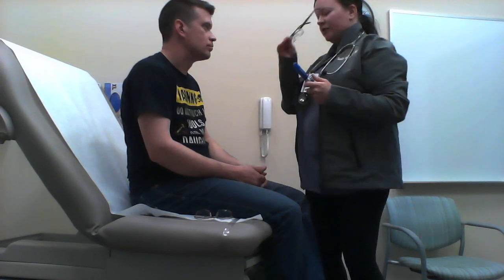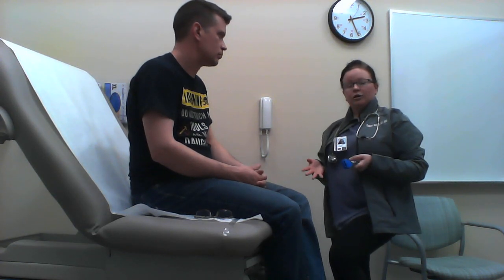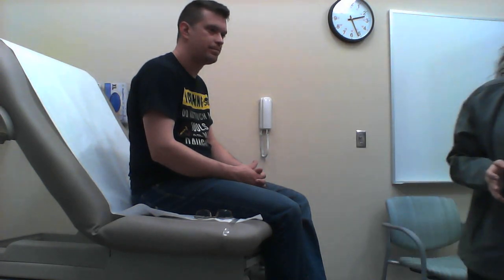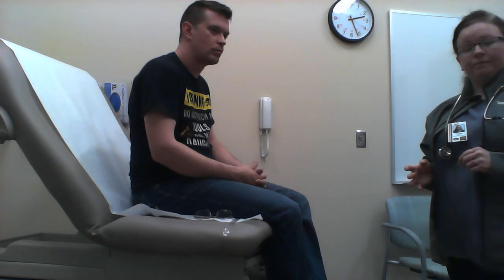And his disc margins are clear. Arterioles look good, no narrowing, no abnormalities. So, yeah, his pupils were reactive to light.